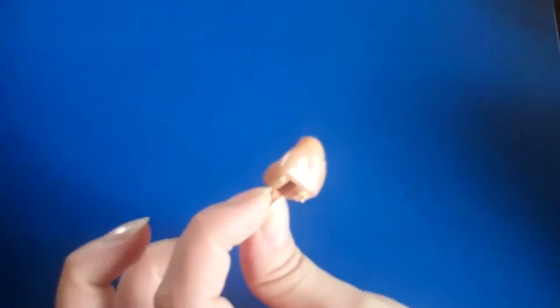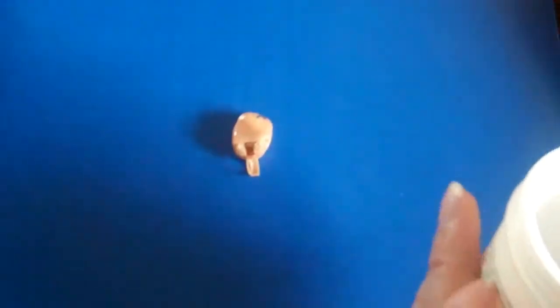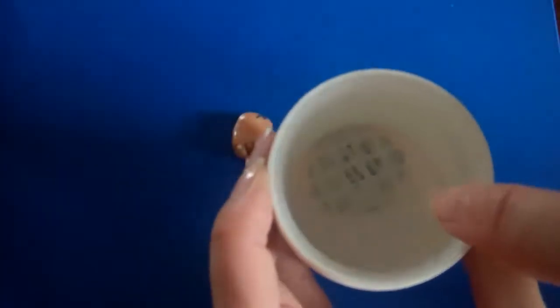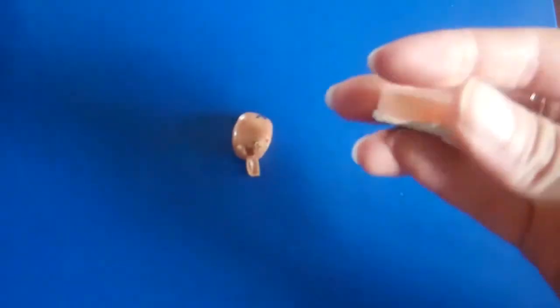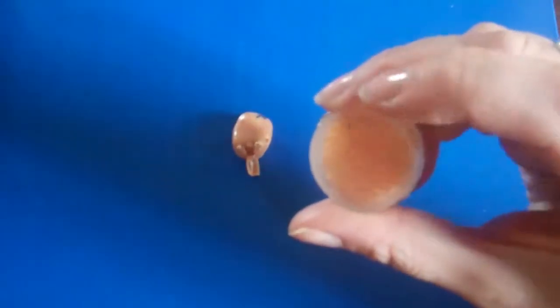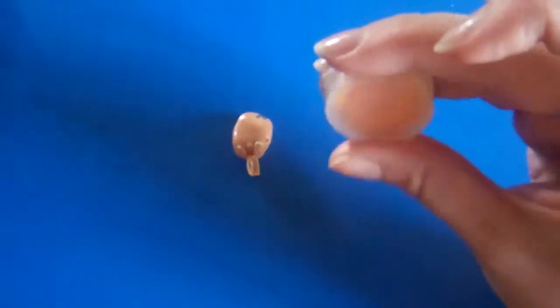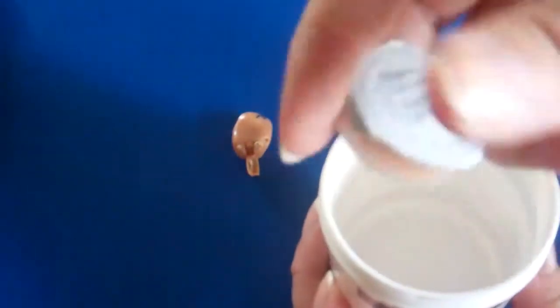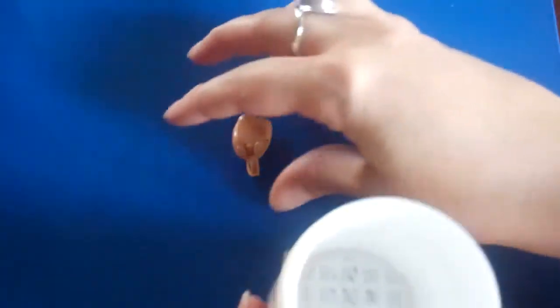Once that is complete, we ask that you place it into a drying jar. So our drying jars look like this. And in the bottom, you will see there's a little basket that can be removed and a little pellet of silica beads. The silica naturally dries out moisture when it's in the bottom of the little jar here. So you place this in the base, like so. You place your little basket on top.